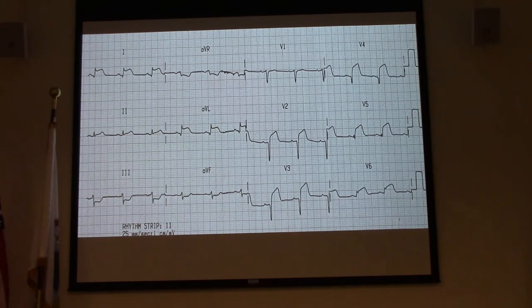All right, if we take a look at this one, lead 1 is elevated, 2 is fine, 3 has depression, aVL has elevation, aVF has depression, V1 is good, V2 is elevated, V3, V4, V5, and V6 are all elevated. Again, we have some reciprocal changes in the inferior from our lateral wall. V1 is fine, so it's not septal, so this is an anterior lateral wall infarct. We've got our Q waves that are greater than 1/3. We've got some pathological Q waves going on here.